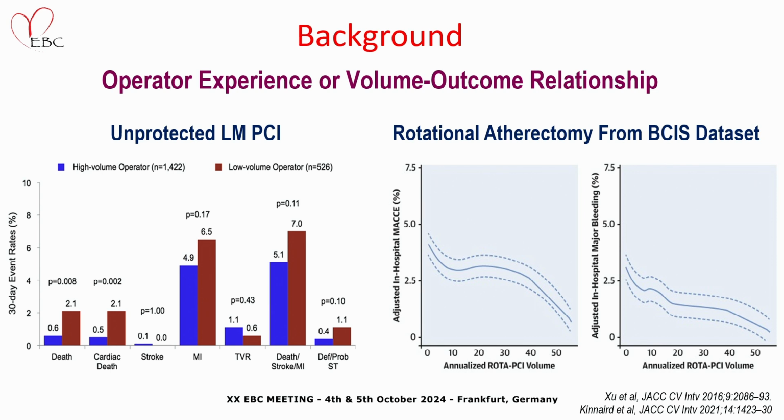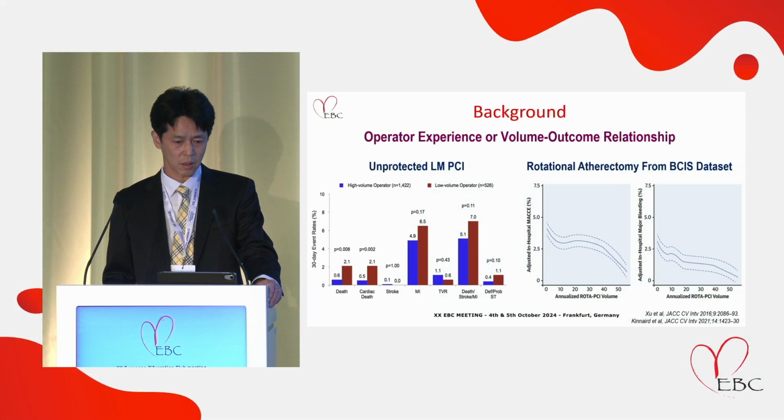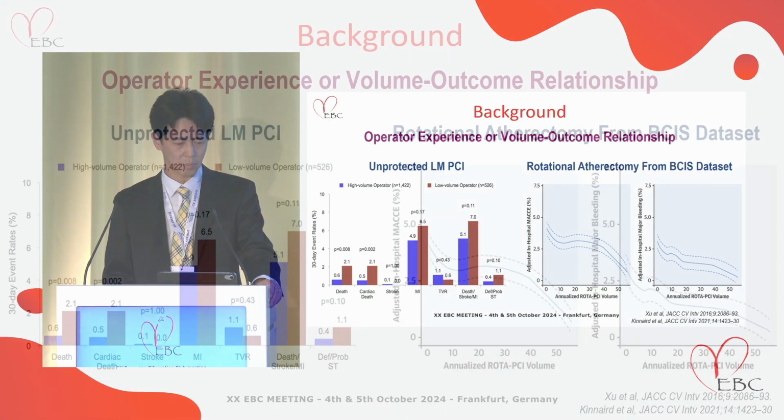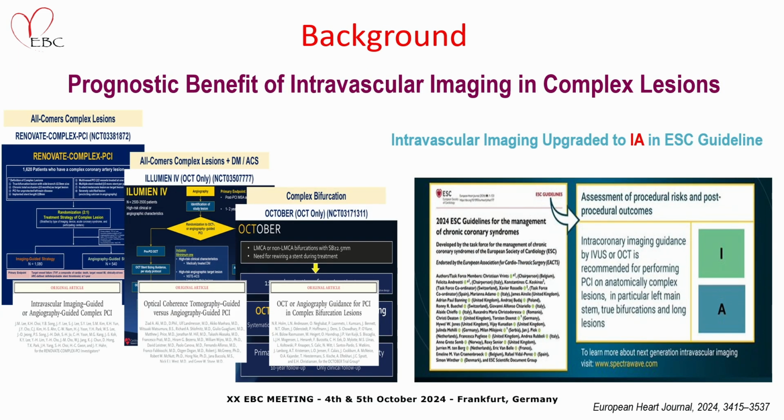In this setting, operator experience becomes crucial. Previous studies have demonstrated that high volume or operator experience was associated with a significantly lower risk of major adverse cardiac events, particularly in complex PCI, such as unprotected left main or those requiring rotational atherectomy.